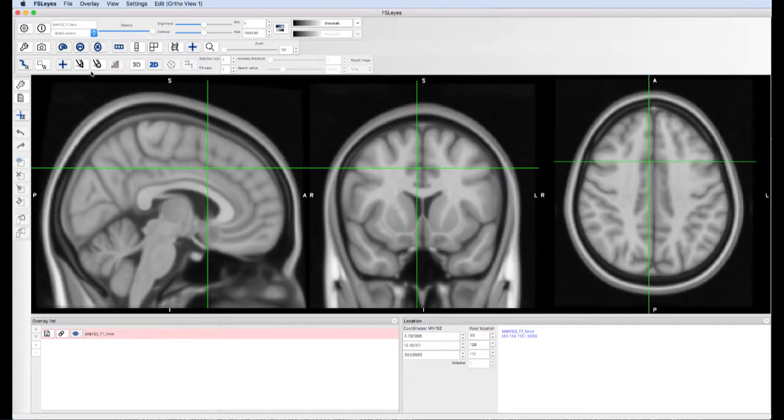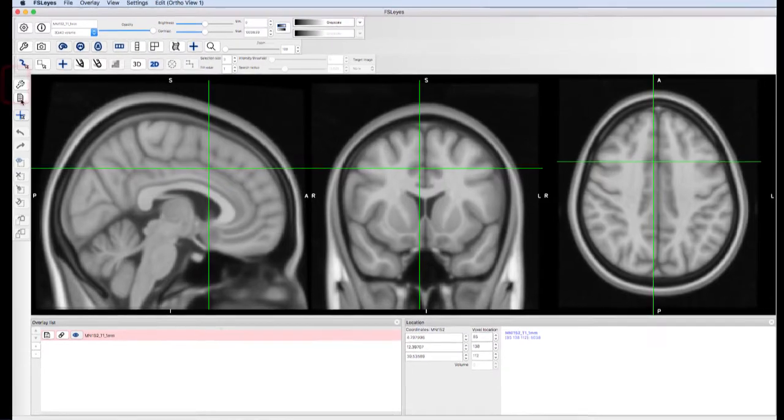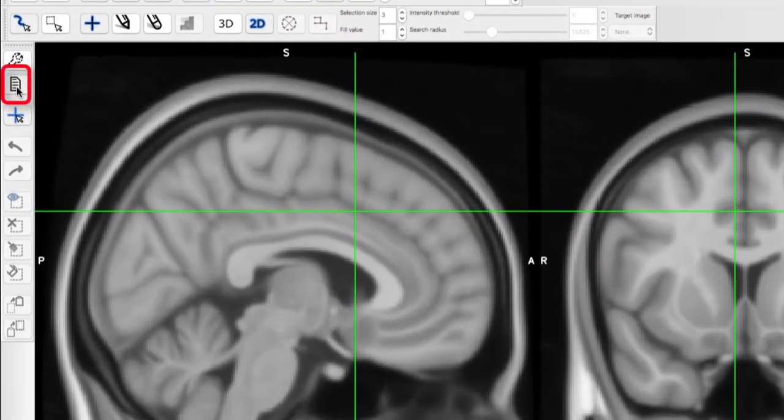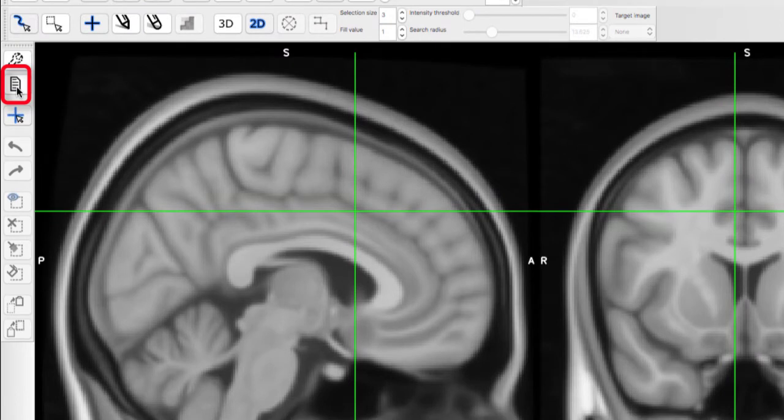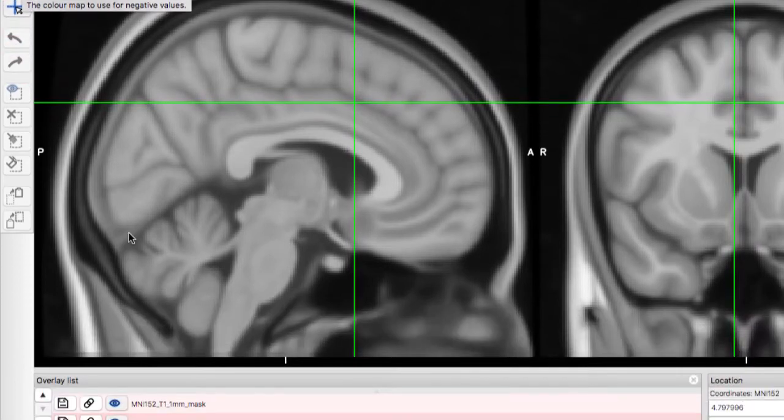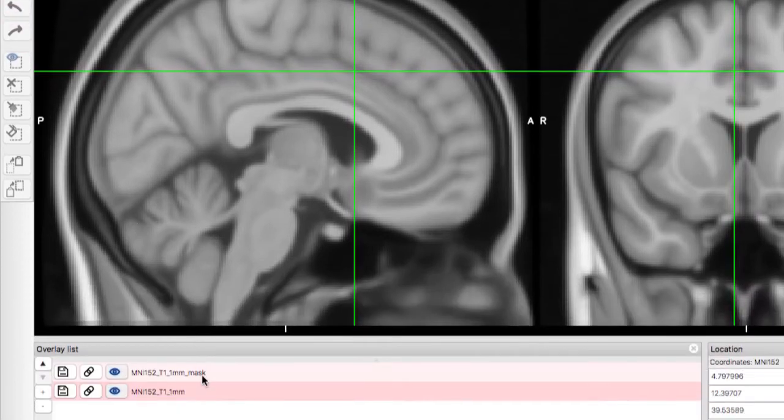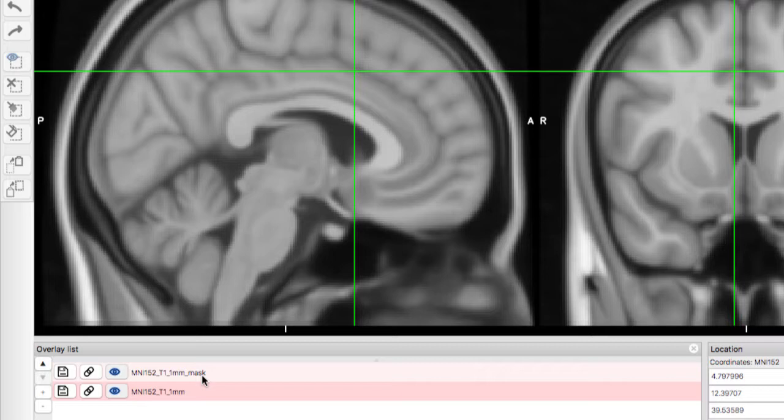The first thing you'll want to do is create a copy of the current data set. This creates a blank copy that has the same dimensions as the parent data set. Make sure that the mask matches the data you will be using for an ROI analysis.